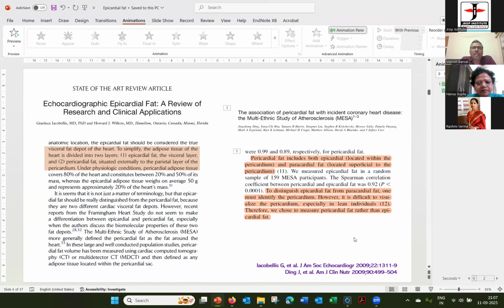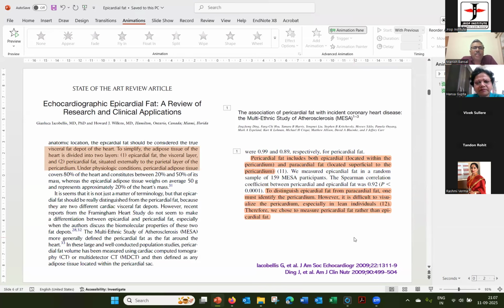The problem comes when a patient could have tubercular pericardial effusion and now has an organizing effusion, as someone had asked also. But in those cases, we have to use our judgment. We have to look at all the features, other parameters, and what the patient has come to us with. So in an obese patient undergoing echo where we find this, we'll label it as epicardial fat along with pericardial effusion. And Rashmi had a very nice example of that. Both were also present.